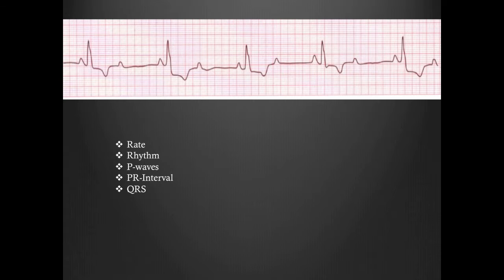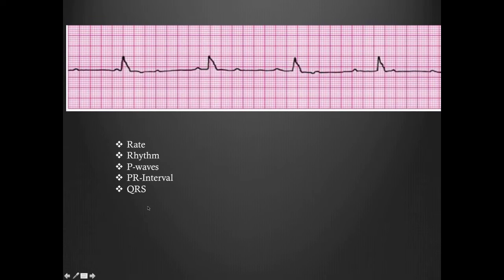So like I said earlier, this is where we see these wide QRS complexes in a Mobitz. And then what's the conduction ratio? I see one QRS complex for every 2 P waves. So we got a 2-to-1 conduction ratio. Okay, now let's move on to our third rhythm strip.